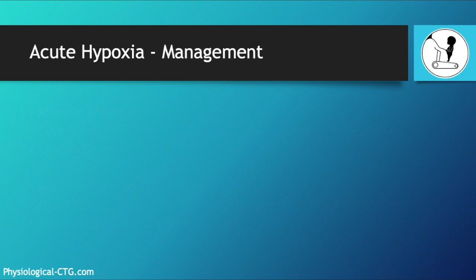How do we manage acute hypoxia? When I talk about management, I will be discussing both diagnosis of the presence of acute hypoxia and then how to treat it. With acute hypoxia, the diagnosis is probably the easiest. You can see a deceleration that is lasting for over 3 or 5 minutes, hence the diagnosis already being made. The real problem is, when do you actually make the call?